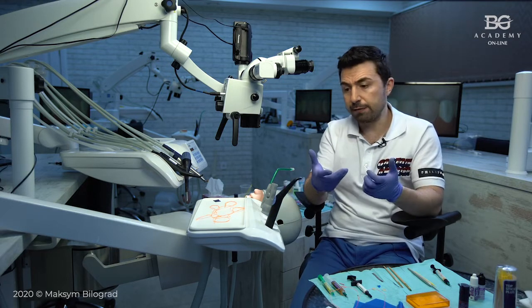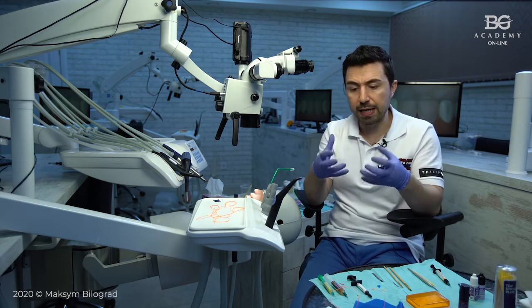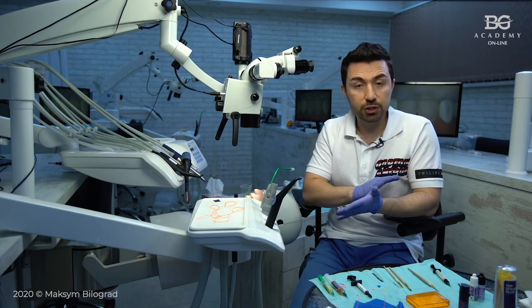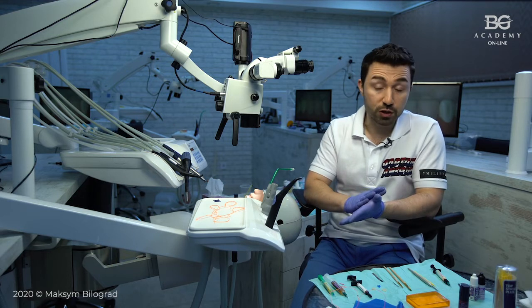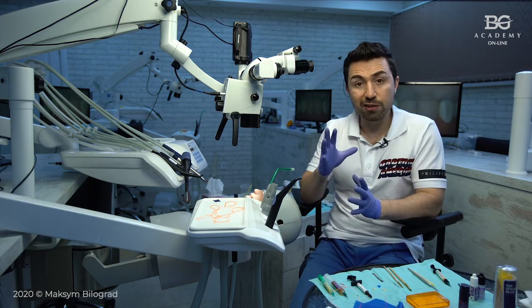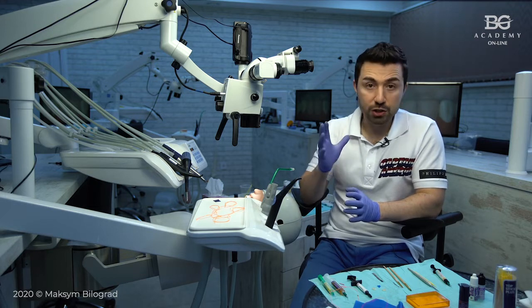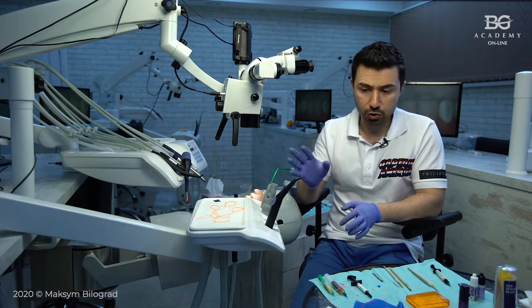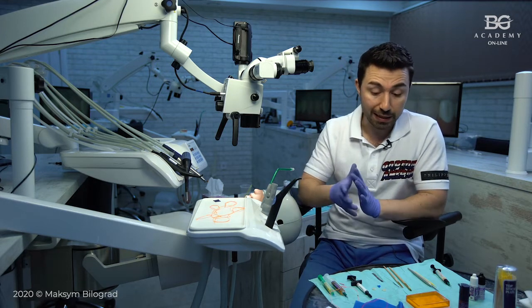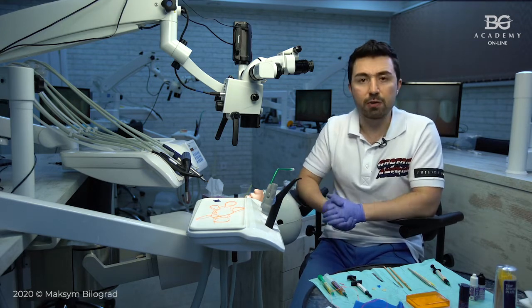So don't be afraid if your dental technician gave you veneers already silanized, because once the surface of the ceramic is silanized, this surface is hydrophobic. This surface is not afraid of any contamination. So you can make the try-in, then you just disinfect them with ethanol, and then you can bond them easily. So this is the first scenario.